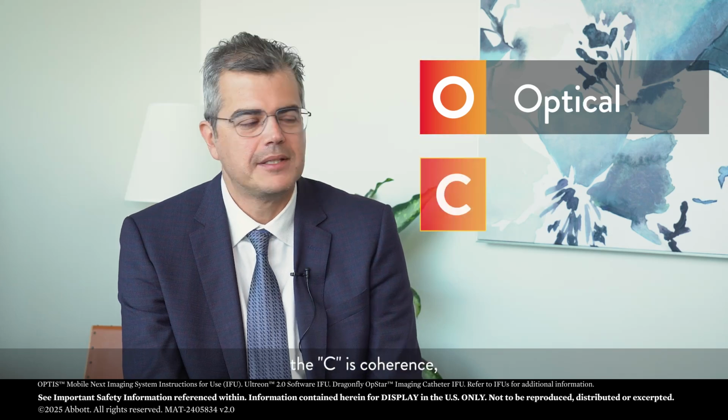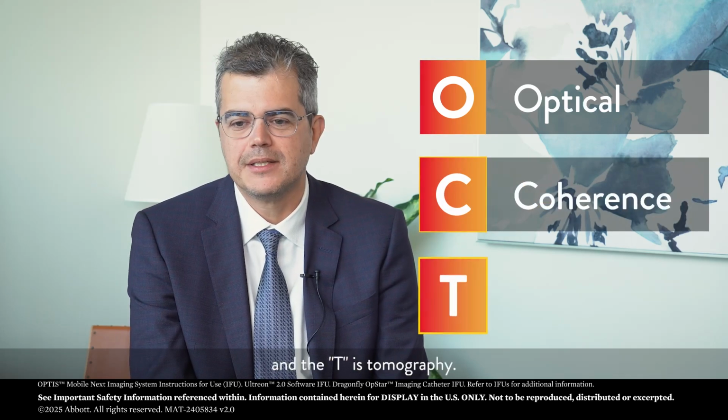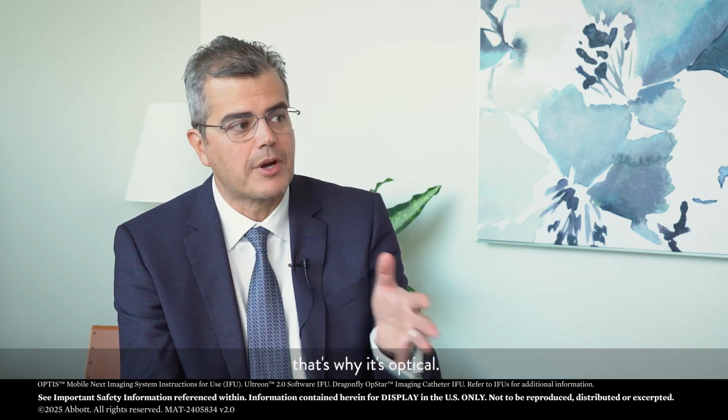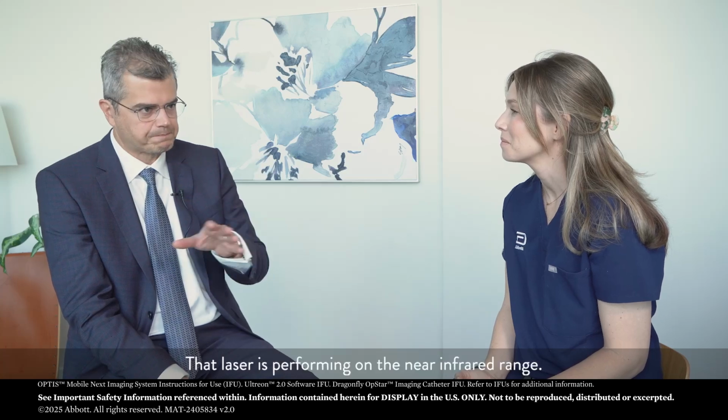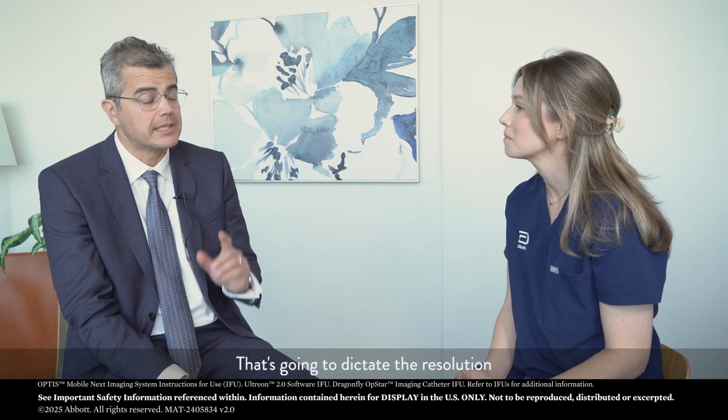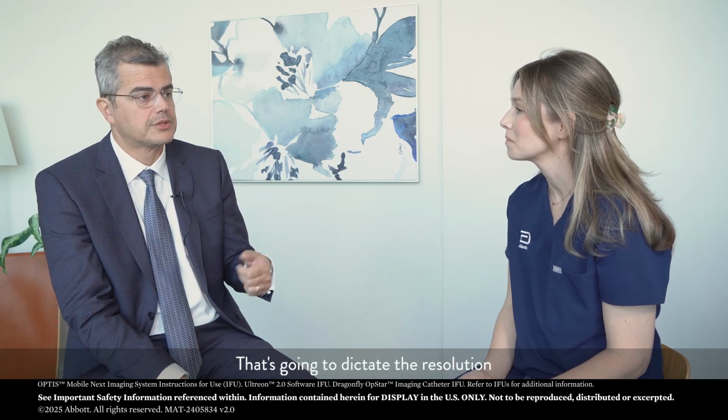So the O is optical, the C is coherence, and the T is tomography. Think of OCT as intravascular imaging in which the energy source is laser. That's why it's optical. That laser is operating in the near infrared range, which is going to dictate the resolution and the ability of tissue penetration of that energy. The C stands for coherence.